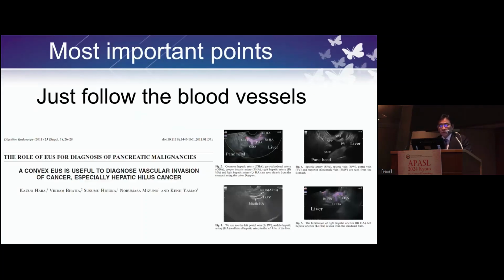In 2011, more than 10 years ago, I published a paper. This is a liver anatomy. I explained the liver anatomy in this paper. So I recommend following the artery and the portal vein, because it is very easy to understand the segments.